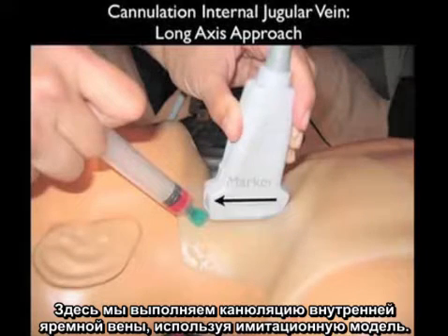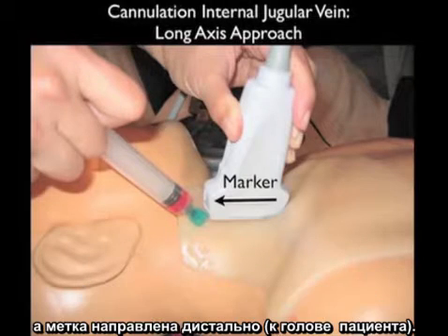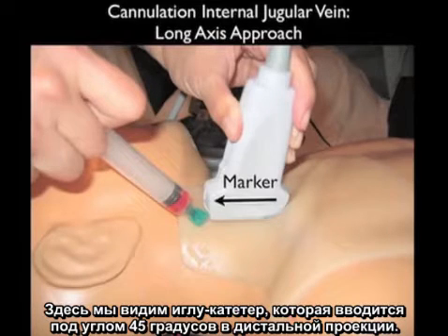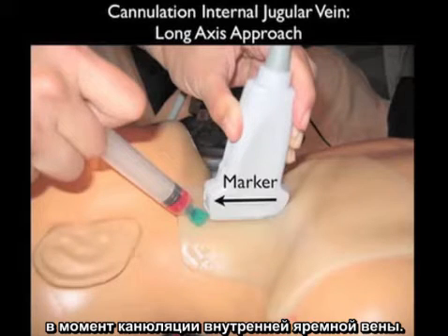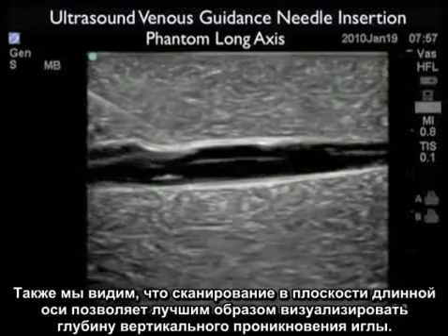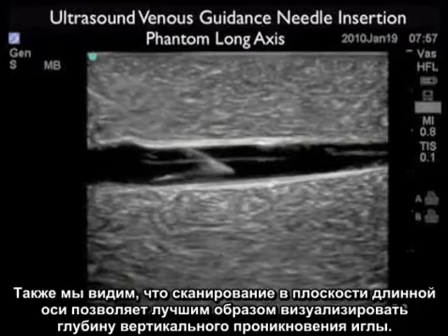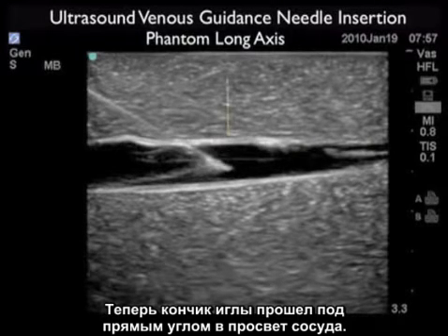Here we're performing cannulation of the internal jugular vein on a simulation model. The probe is oriented along the longitudinal or long axis course of the internal jugular vein with the marker dot distal, towards the patient's head. The needle comes in at a 45 degree angle underneath the distal aspect of the probe, allowing us to see the entire aspect of the needle as it travels from the surface all the way down to the venous lumen. Here we see the long axis approach with the needle coming in from left to right, and the needle tip squarely within the vessel lumen.